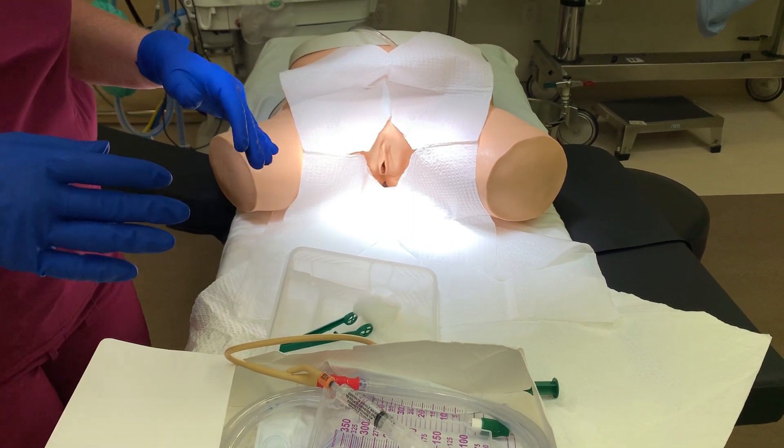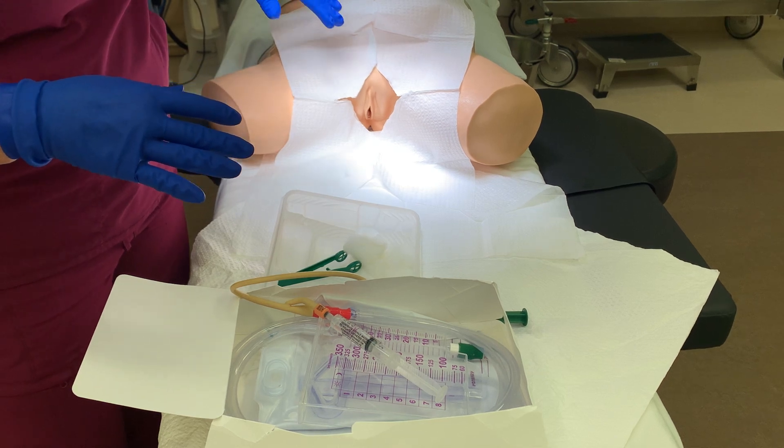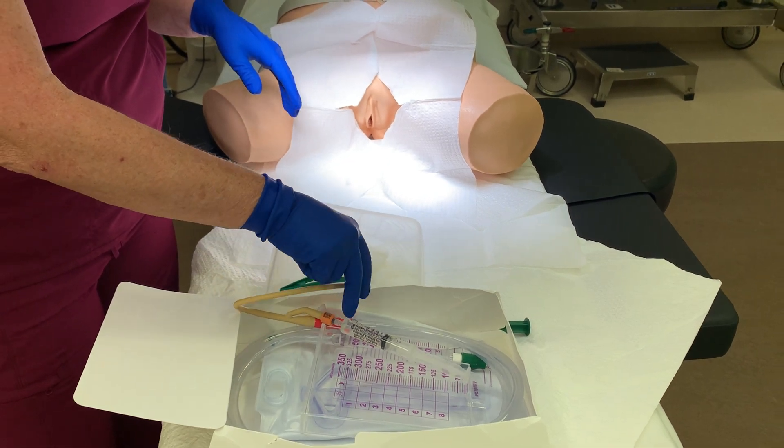As you can see, we have already opened our kit. I've already gloved, I've already draped the patient, I've already tested the balloon, and I've already lubed the catheter.